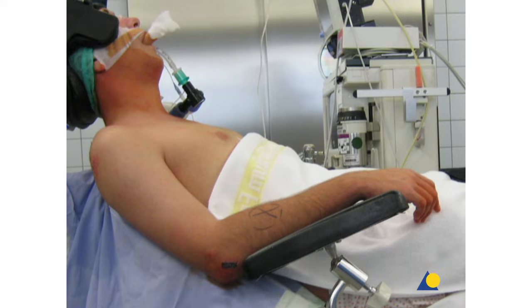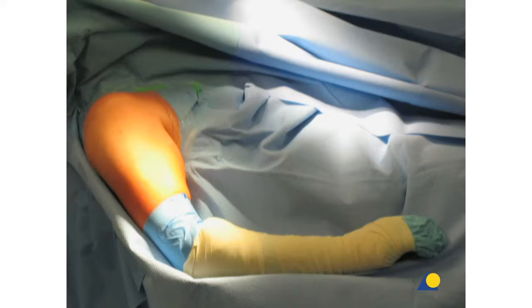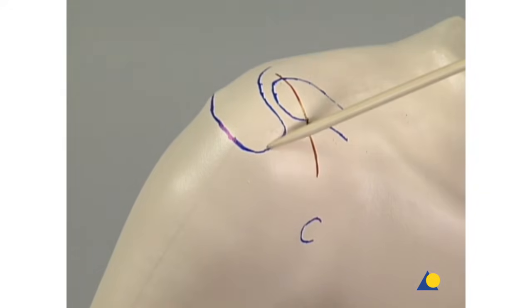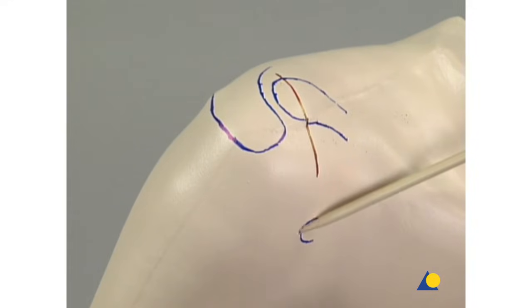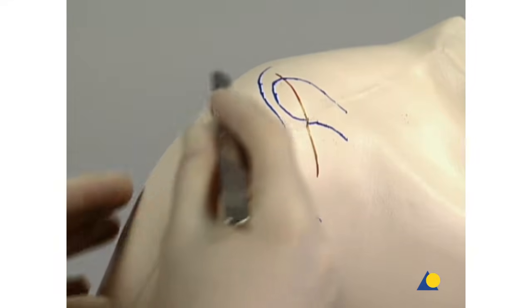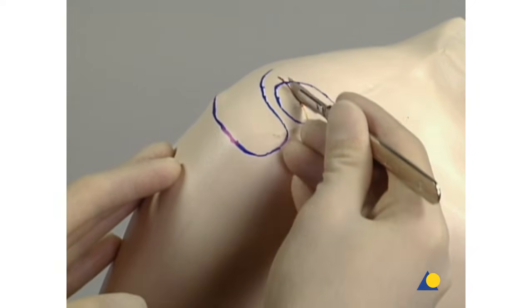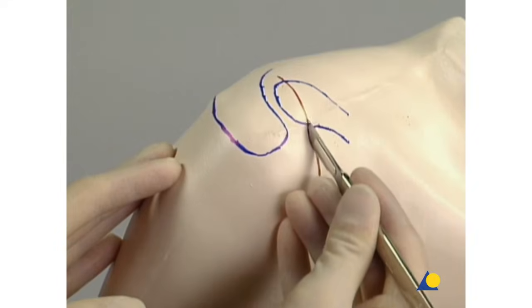Excessive extension of the neck is avoided. The support plate under the treated shoulder is removed. On the injured side, the draping of the arm should allow free movement of the shoulder. The anatomical landmarks are the lateral clavicle, the acromion, and the coracoid. Through a superior saber-cut incision located slightly medial of the AC joint, the delto-trapezial fascia is exposed.